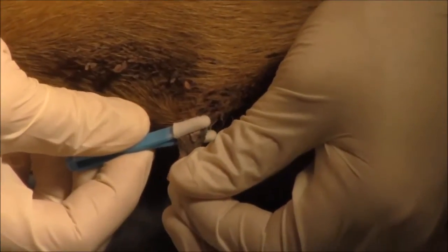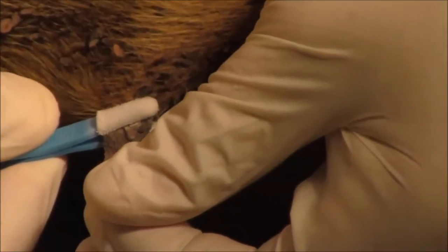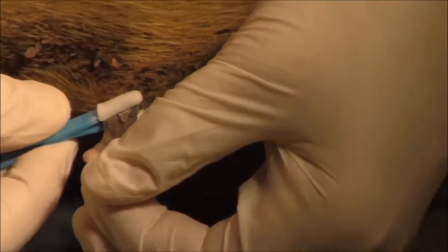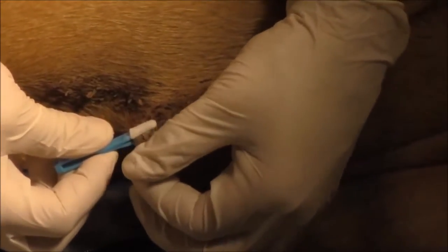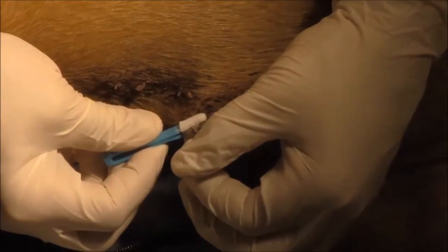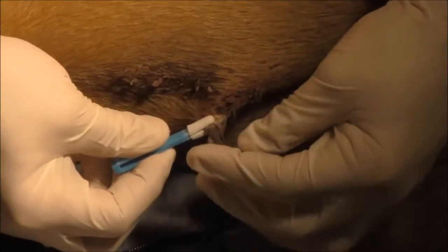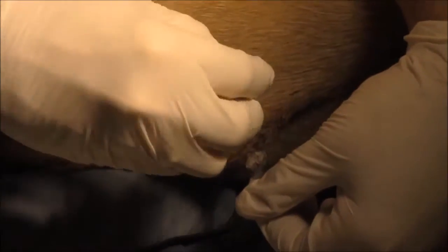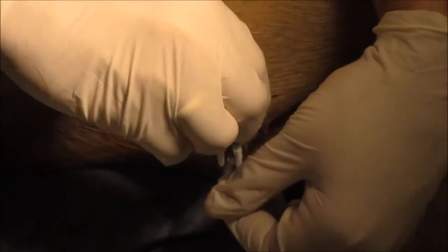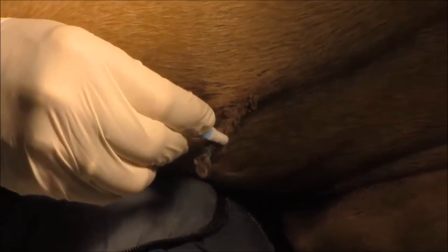Just move it around a little bit. See, he's got all these little skin tags that we can take off — it will take a little more time. For this video I wanted to show you it on this big one because that's usually what people come in about. Typically these big dogs get them on their chest from laying too long on that one area.